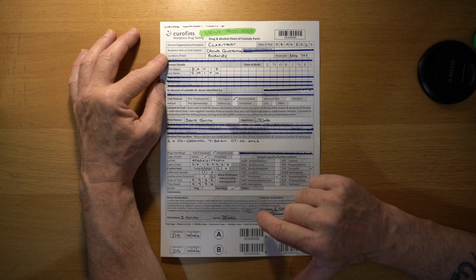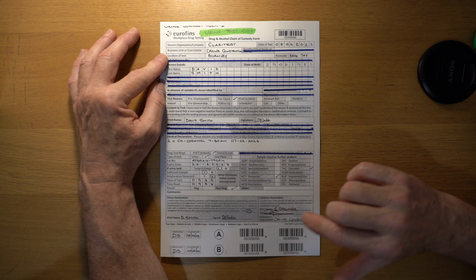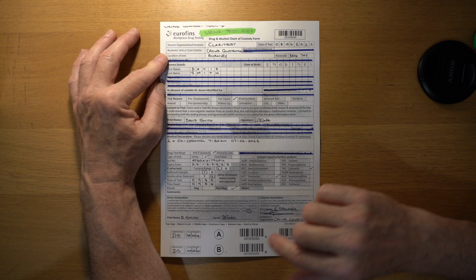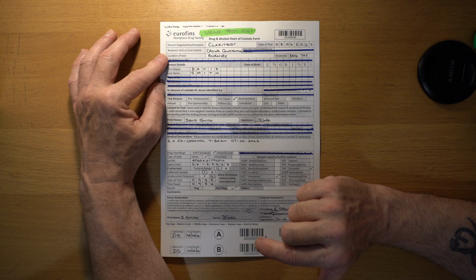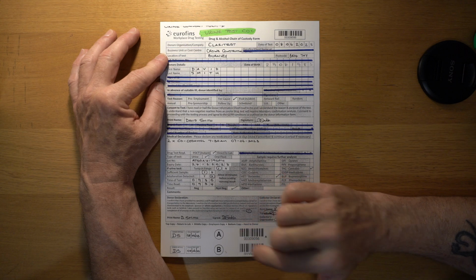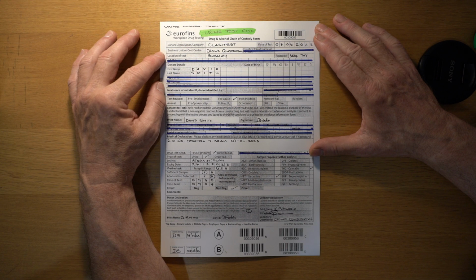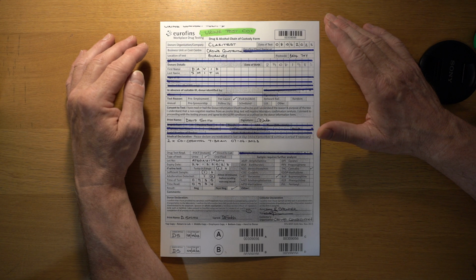Doing a declaration of medication, so they'll need to read and sign and print their name on that declaration there. And you'll need to read, put your name and sign on the collector's declaration. And then underneath that, the only thing left to do is for them to initial and date the 2 tamper-proof anti-tamper seals at the bottom, one marked A and one marked B. They'll need them signed, initialed and dated before we affix those to the vials of urine for sending off to a laboratory. And that's how to complete a chain of custody test consent form for urine.